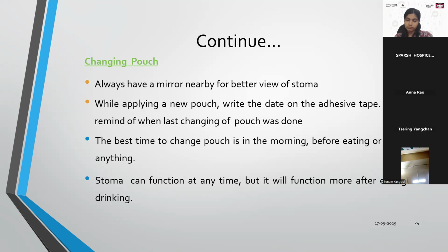That is why nurses are very important in any care. They have to ask, find out, so that you come to know that generally bowel moves anytime, and it will move more once the food is taken. But we can train the person. Further we will see about the irrigation also, so with a small pouch also they can manage. And another time is before meals, because once they eat, fresh stool will come. So that is also a good time.